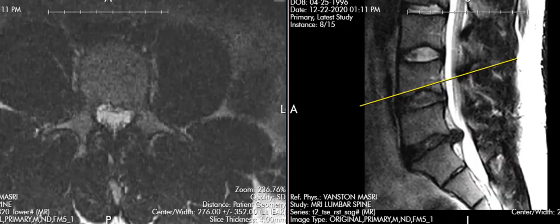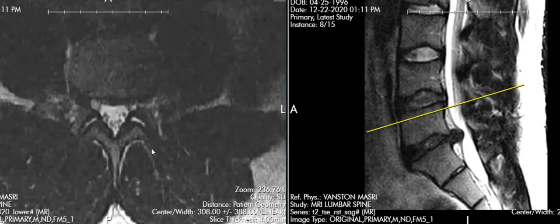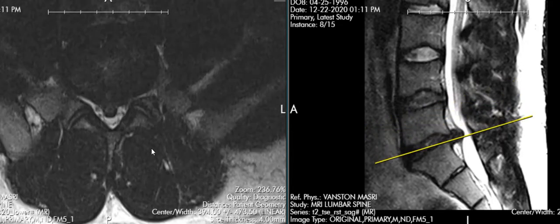this patient. So this is a young 24-year-old gentleman who sustained a disc herniation. Now, the picture on the right, which is over here, is showing that disc herniation on the MRI scan. This is the L5 vertebral body. This is S1. And you can see the center of this disc is basically shot all the way out. On the left is a top-down view of the spine. This gentleman's got a very, very healthy spine with some really large muscles in his back. But here is that disc herniation.